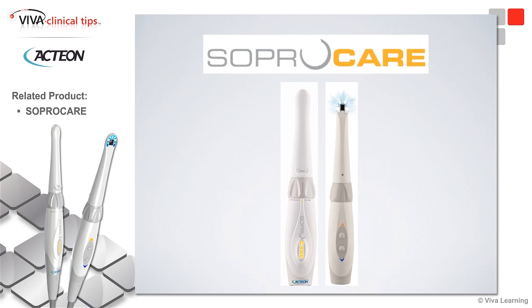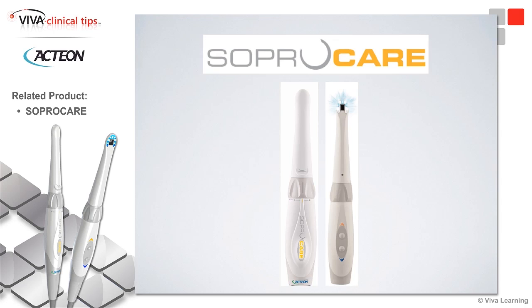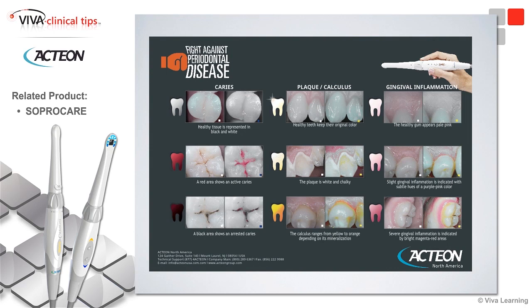It has a daylight mode, so you could use it, in this instance, like we said before, showing the patient how they're doing with their home care. But we can also use it in a different mode, a different wavelength of light, called a Perio mode. And so we're going to talk about that in a moment.